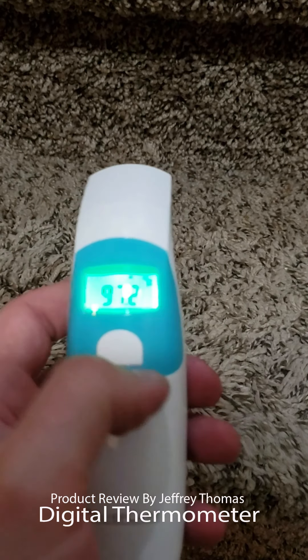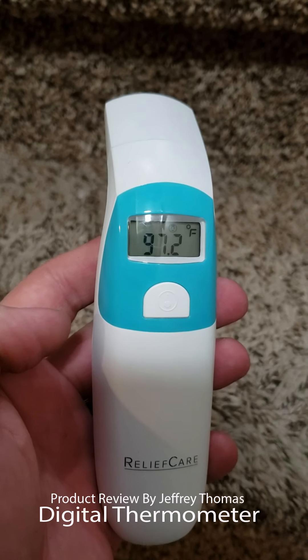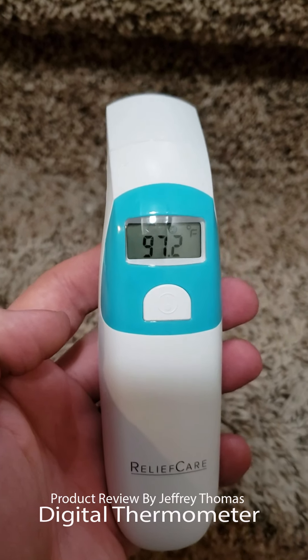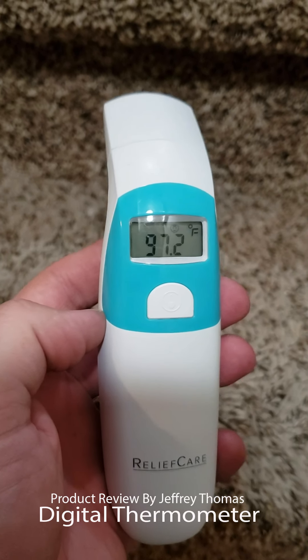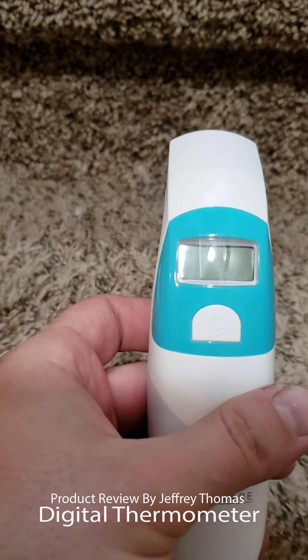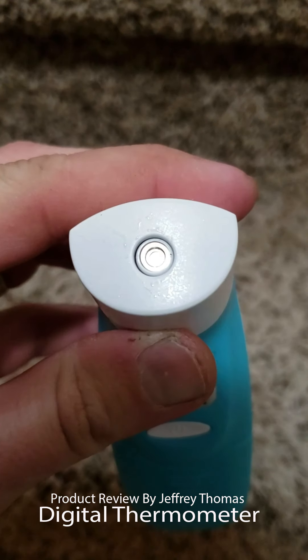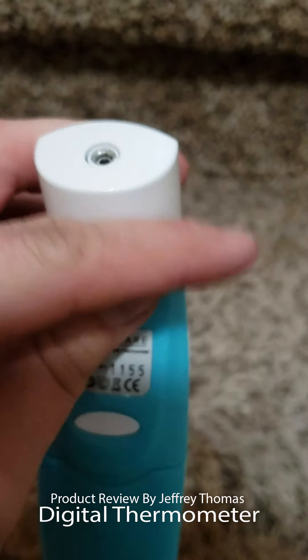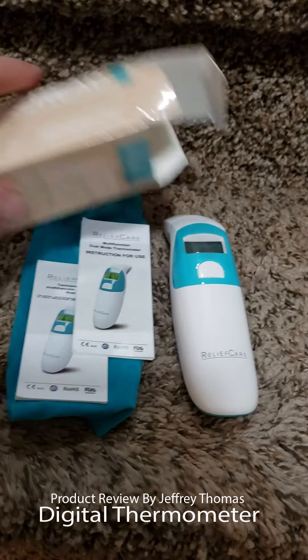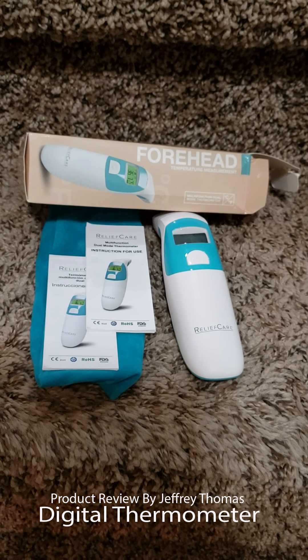If there's a fever, this whole screen will beep and turn red. It also has an auto turn-off feature — it'll turn off on its own, or you can just press the button to turn it off manually. The unit is made of hard plastic and doesn't feel cheap at all. There's your sensor right there.